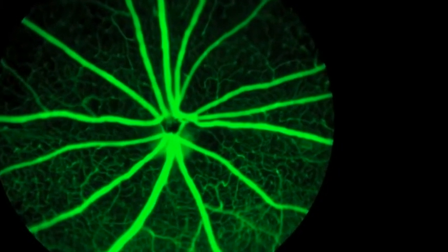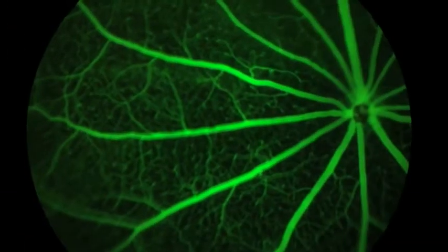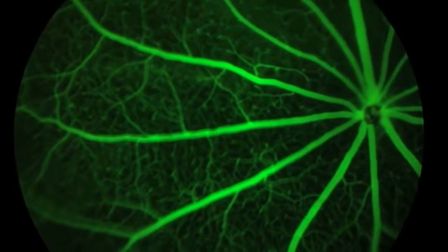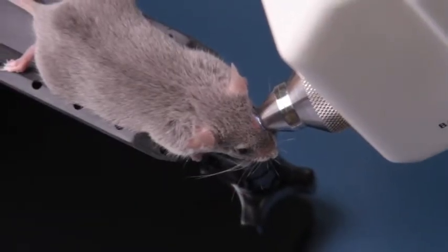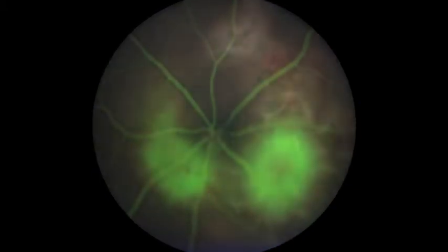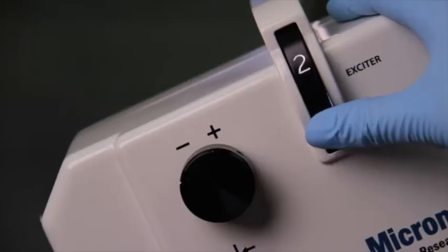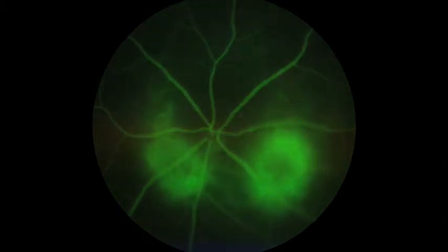In this example, the flow of fluorescein-stained blood cells can be seen in the capillaries. In the left eye of this mouse, fluorescein is seen in the bright field image — it shows up in the blood vessels as well as in the scars created by the Micron 532 laser. By turning the exciter and barrier filters to position 2, full fluorescence is visible.